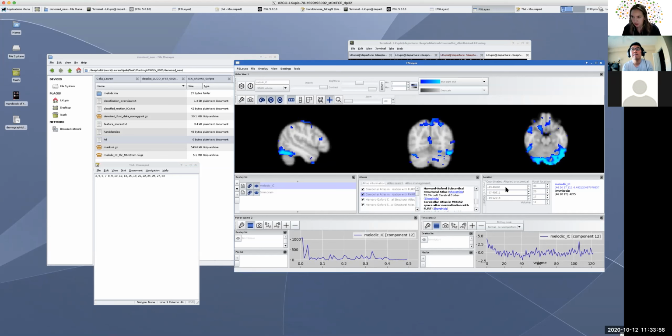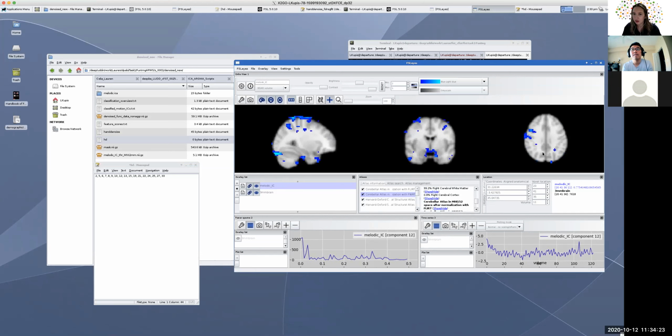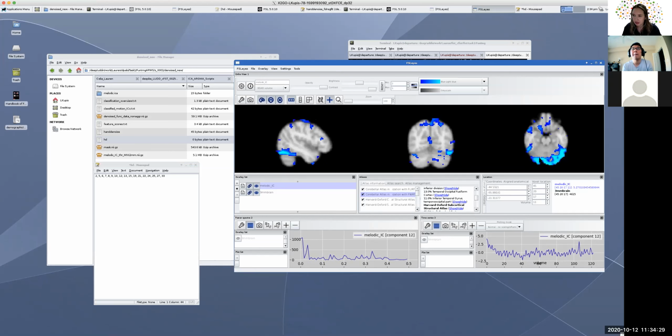So I'm more leaning towards the noise, and also this has a little bit of spikes there, but again, it does have a good spike here, so it's a little bit trickier. I think for this one, I would probably put a question mark on it, just because it is a little bit of both. So in that case, maybe leave it in. Let me see though, this is a little bit tricky.